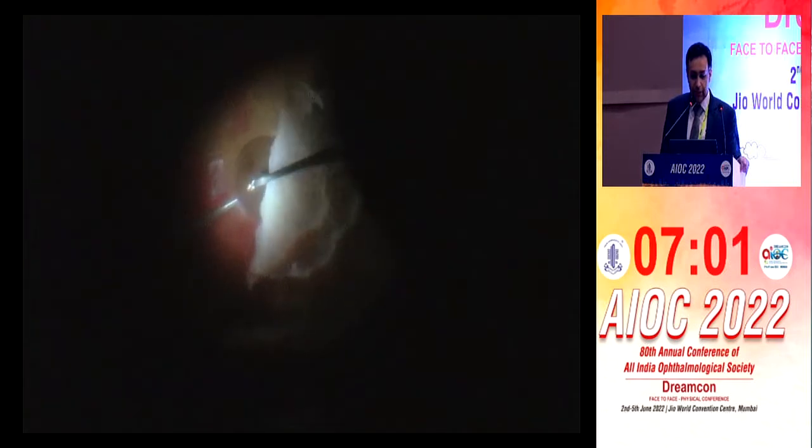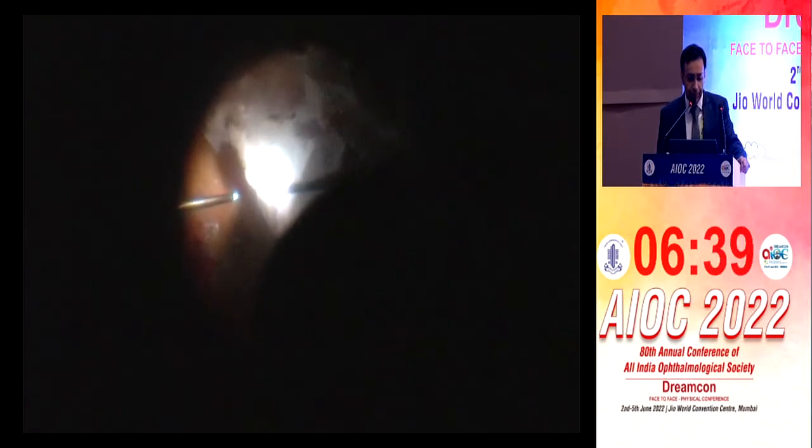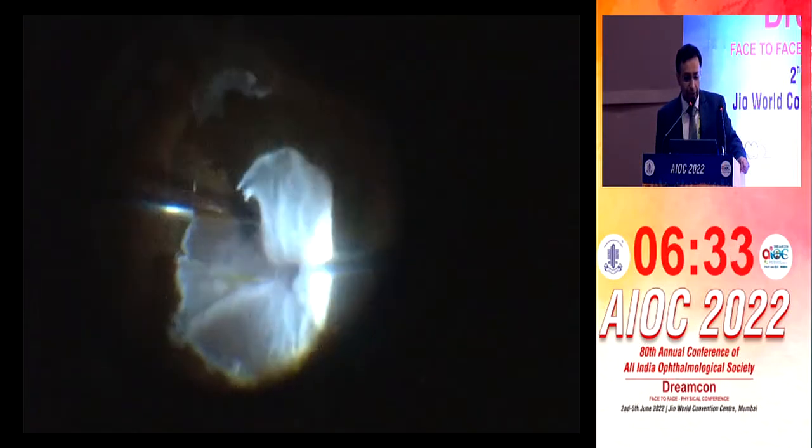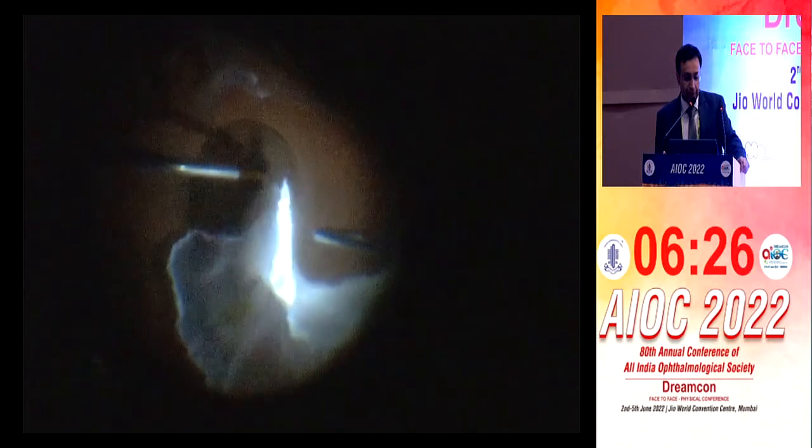This is the 360-degree retinectomy. In the previous operation, some PFO was there — this is the subretinal PFO which is being removed. He's trying to look for anything underneath — any PFO left. If you're going something so aggressive, you have to go all the way. Now he's putting PFO and it's sliding off. Why is this PFCL not staying?